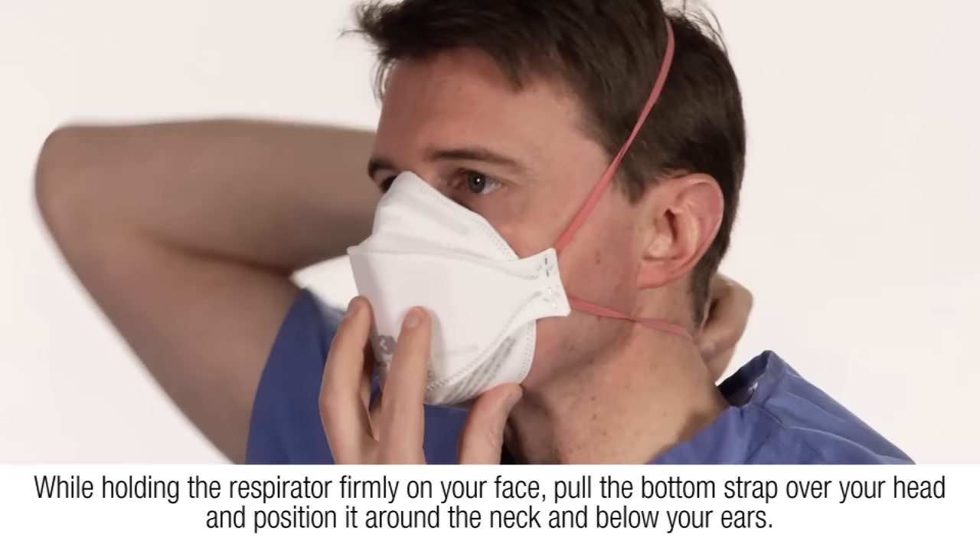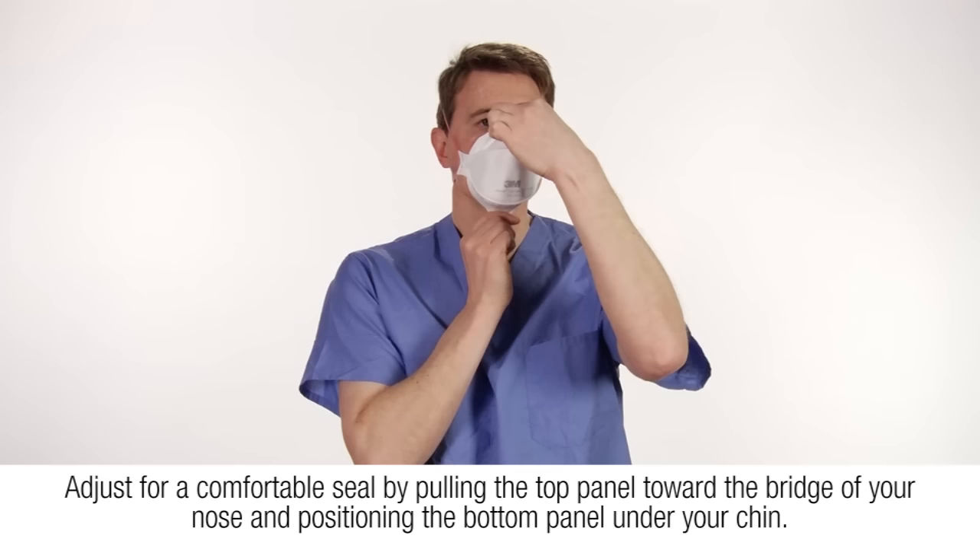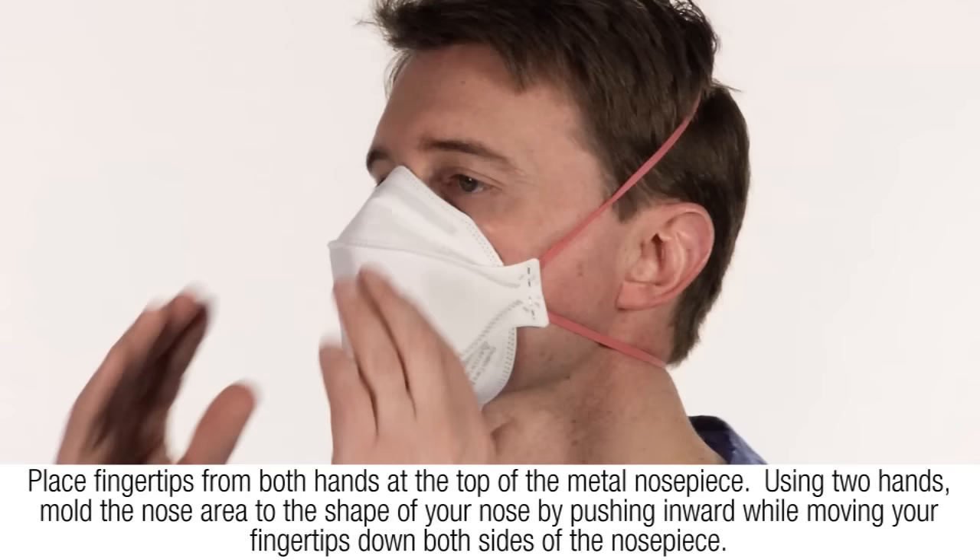Pull the bottom strap over your head and position it around the neck and below your ears. Make sure the straps are not twisted. For increased comfort, adjust for a comfortable seal by pulling the top panel towards the bridge of the nose and positioning the bottom panel under your chin.